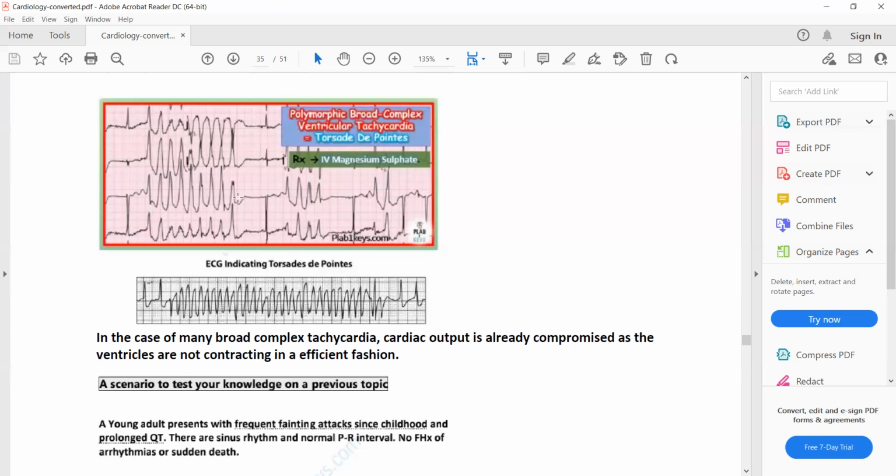But in this part of the ECG strip, you can count the small boxes and see if it's a long QT interval or not. QT interval is from the start of the Q wave to the end of the T wave. So you will need to count the small boxes starting from the start of the Q wave to the end of the T wave.